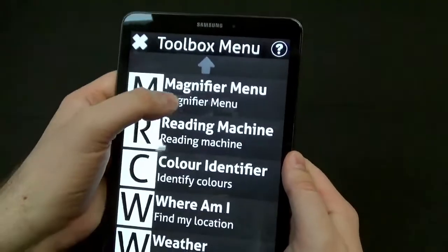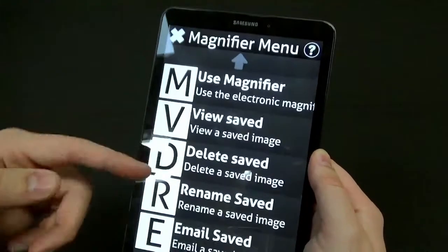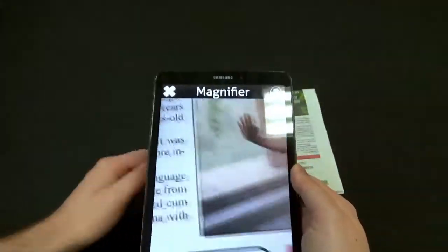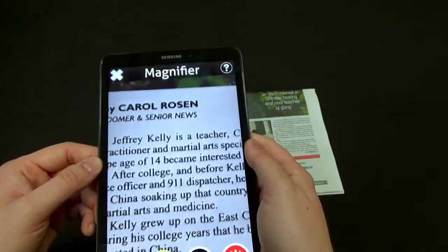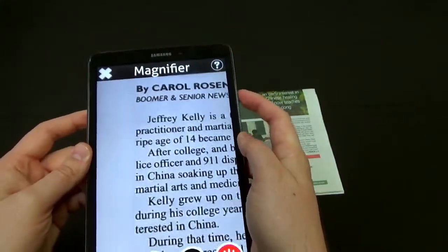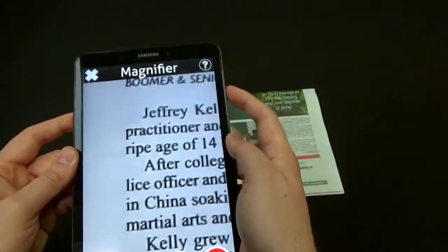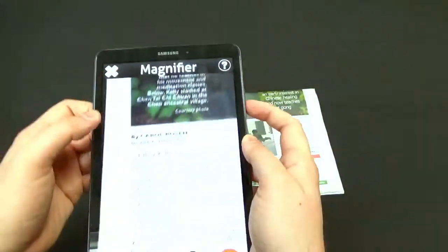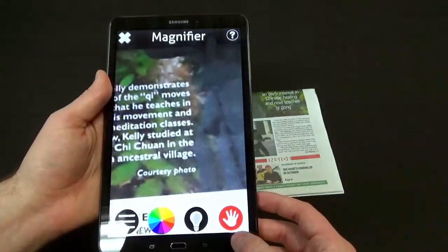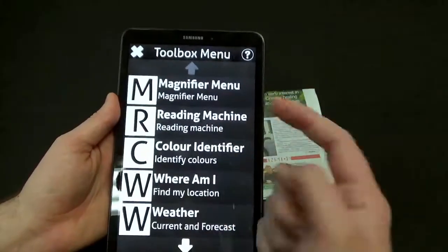Now let's look at the toolbox options like the magnifier. Using the magnifier, you can also save screen captures, delete, or rename them. I have a little local newspaper here, so let's test out the magnifier on it. They're going to add pinch and zoom pretty soon, but right now you use the volume up or volume down to increase or decrease your zoom level. It does a really nice job for a tablet. At the bottom you can change color modes, turn a light on and off, freeze frame, and snap a picture once it's freeze-framed.